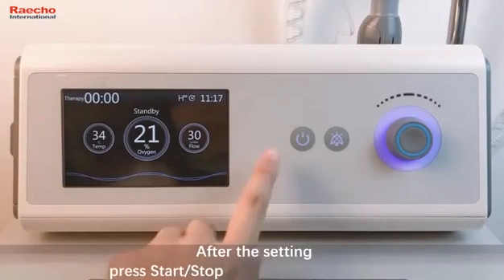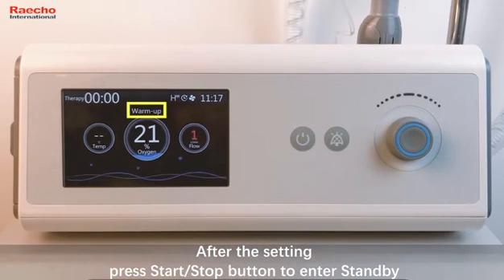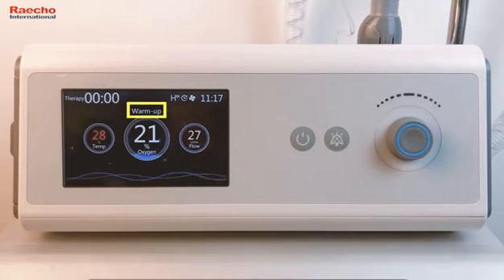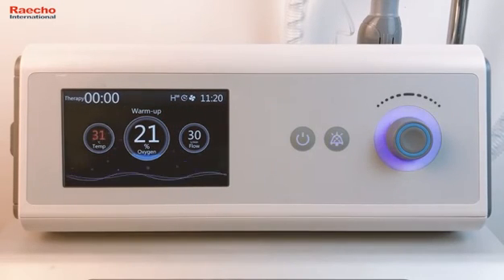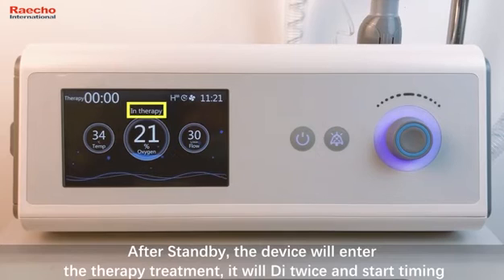Operation. After the setting, press Start Stop button to enter standby. After standby, the device will enter the therapy treatment. It will beep twice and start timing.